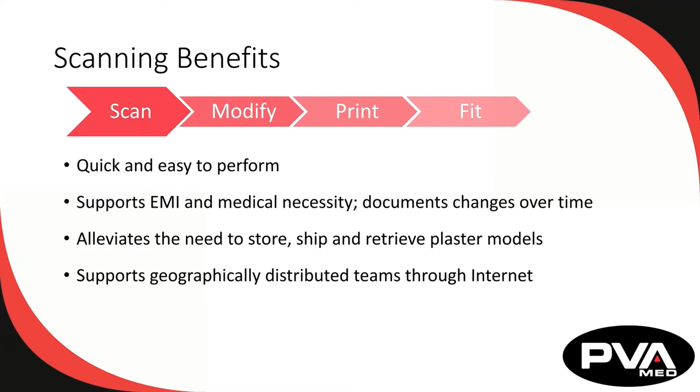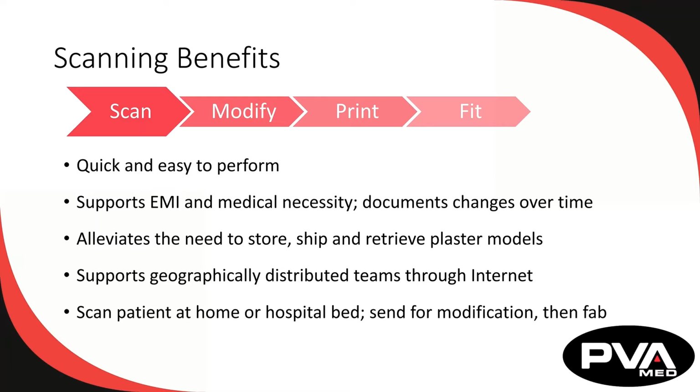For example, your practice could easily support scanning a patient at home or in a hospital bed. The completed scan can then be modified from anywhere to design a check socket using computer-aided design or CAD software, then sliced to be prepared for printing using CAM or computer-aided manufacturing software. The resulting print-ready Gcode can then be securely shared online for automatic fabrication, either internally or through a central fabrication facility.